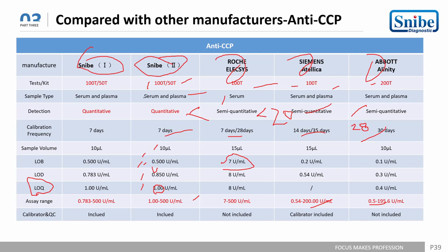The quantitative analysis and the semi-quantitative analysis is a term in which if some cutoff is given, like for the anti-CCP, if the cutoff is less than 20 it is considered negative, and greater than 20 is considered positive. And we are claiming in the anti-CCP that the result is quantitative, right? And the calibration and the result you said, U per ml, is not a quantitative analysis.